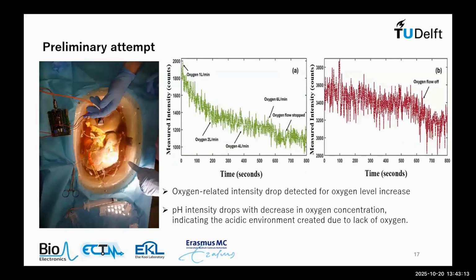We did some initial experiments. This is on a liver. It's a liver that has been rejected, and it was rather noisy. We did manage to pick up a few things here, and part of the problem here is the setup. We were trying to hold it on the tissue here. It was moving, and you had whether putting a little bit more pressure, a little bit less pressure. But now we have to sort out this setup and make it much more effective.